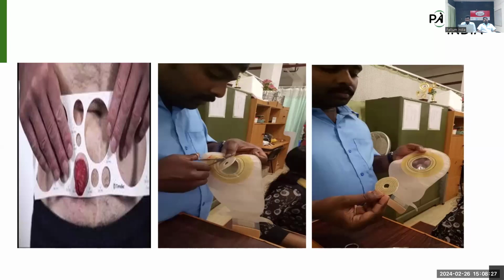Why are we using a curved scissor? If we use a straight scissor, in between the cut area sharp edges will develop. It will disturb the stomal site. If we use the curved scissor, on a pure finishing basis we can cut the stomal opening properly. So there won't be any sharp edges. It will be a very smooth and finished side. So it will not affect the stomal region.